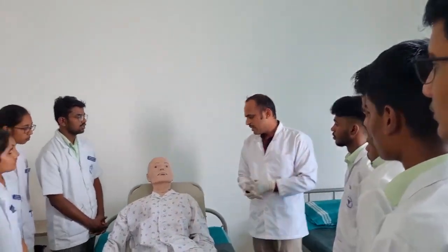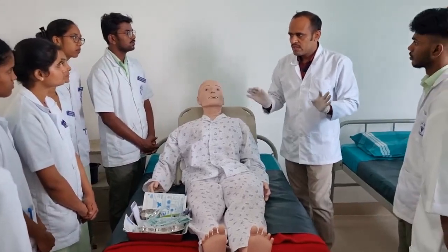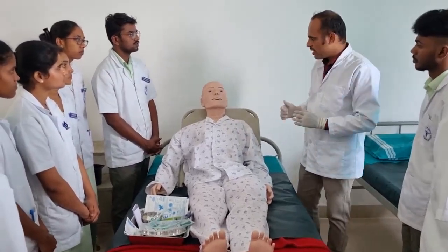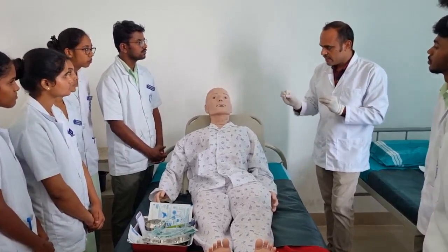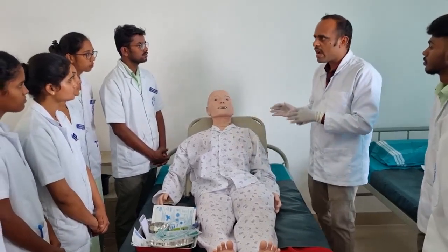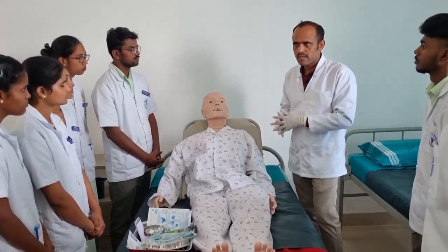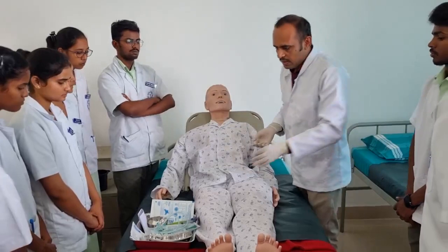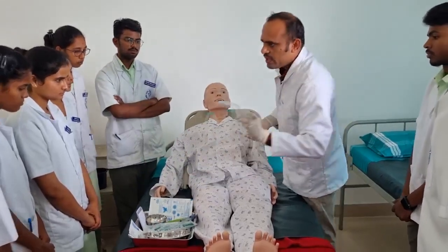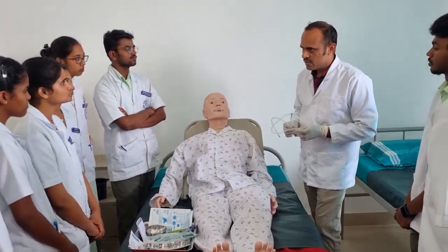Before starting the procedure, we have to check the doctor's order, and after that we start the procedure. If the patient is well oriented, explain the procedure, what we are going to do now. Then we have to take the NG tube. Usually various sizes of NG tubes come.